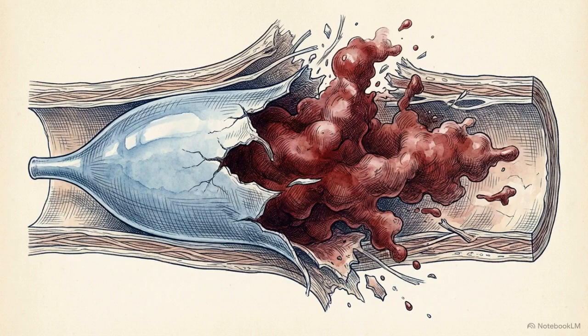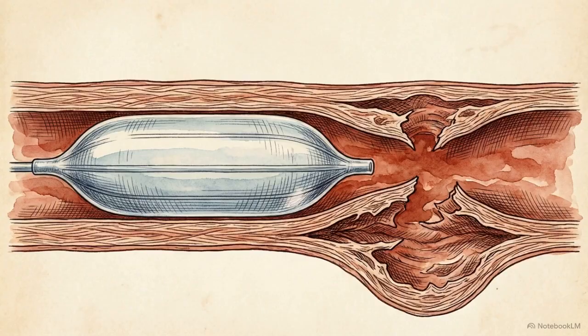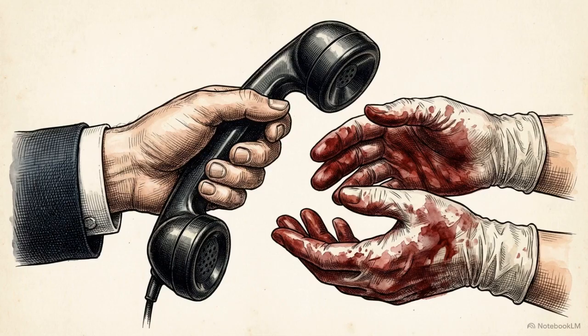If a balloon is oversized, the outward radial force exceeds the tissue's tensile strength, resulting in extravasation. The artery bursts open. The emergency protocol for an exploded vessel relies on the guide wire left in place. The physician rapidly reinserts the balloon over the wire and performs a low-pressure inflation just proximal to the rupture. This creates a mechanical tamponade, stopping the bleeding long enough to call a surgical team.